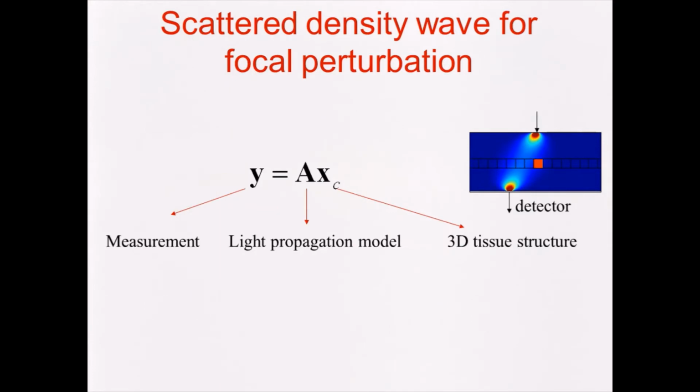So to do this, I want to run through a little bit how we put together the forward model for an instrument. I've shown you a bunch of these little source detector pair measurements, but now let's put them into a mathematical formulation so that we can reconstruct it, or at least model our measurements. So the first thing is the measurements. Most often you work with ratioed measurements for diffuse optical tomography. This might be the light intensity during brain activation versus rest, or this might be the fluorescence intensity divided by the excitation intensity. So that's Y, just your list of measurements.